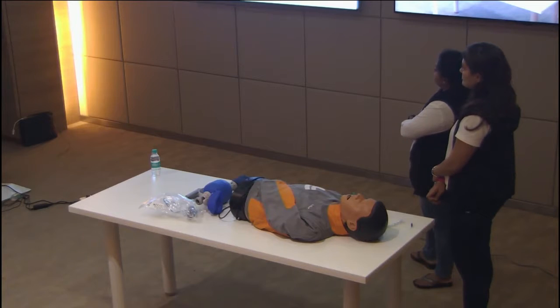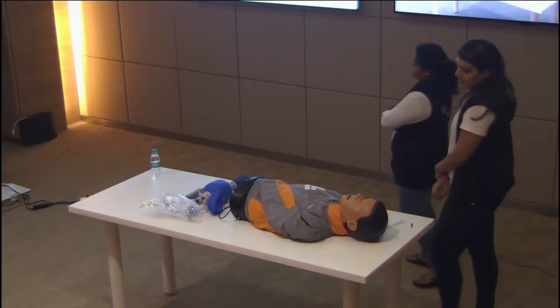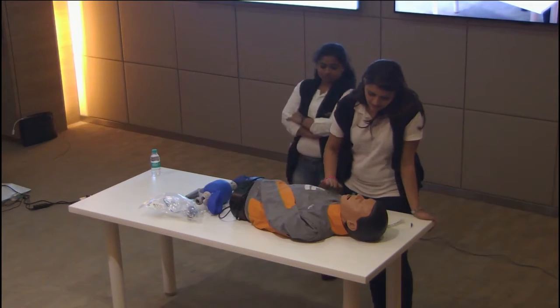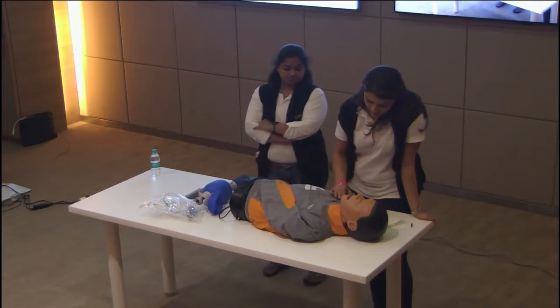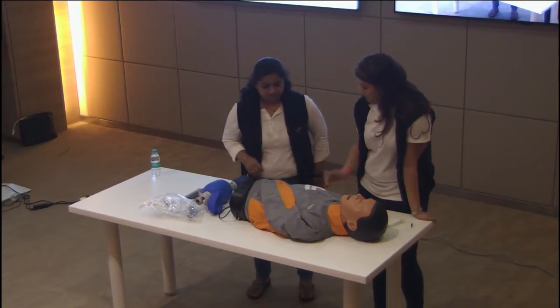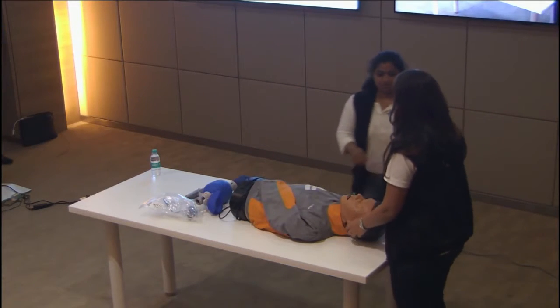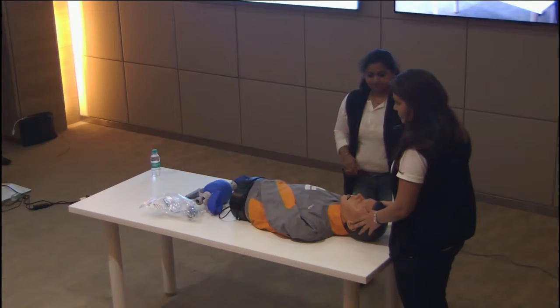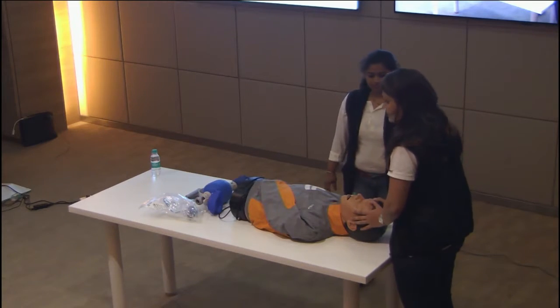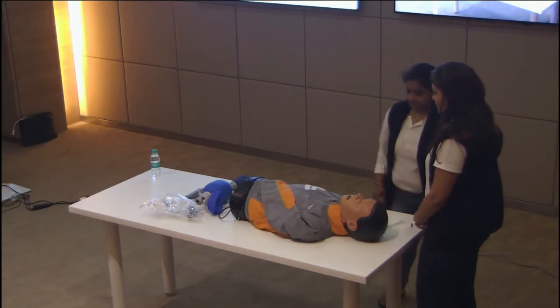I am the person standing at the desk. I'm the nurse, and I page the doctors, and Dr. Paulomi and Dr. Vaijanti come in to take care of this patient. So let's see our typical day. Dr. Paulomi, this is your patient. Hello, sir. Since when are you having this complaint? He's breathing very heavily. We started nasal cannula at 2 liters. We cannot go more than 6 liters as it will cause nasal mucosal drying and irritability. So we just give nasal cannula and see his vitals in the meantime to see if it picks up.